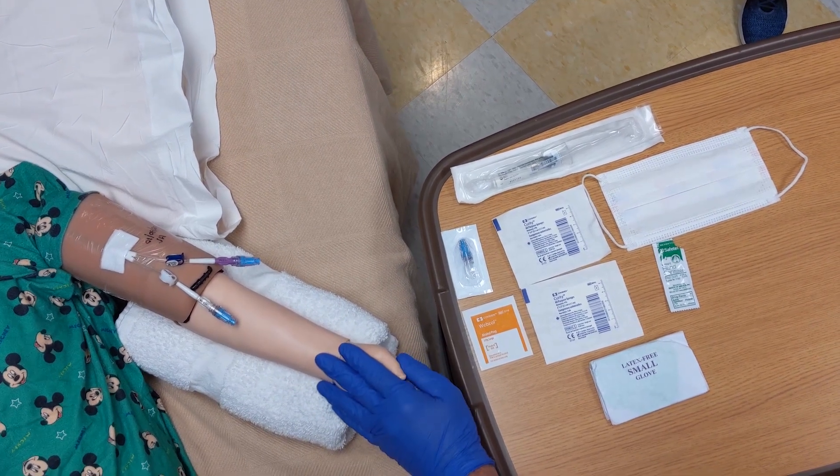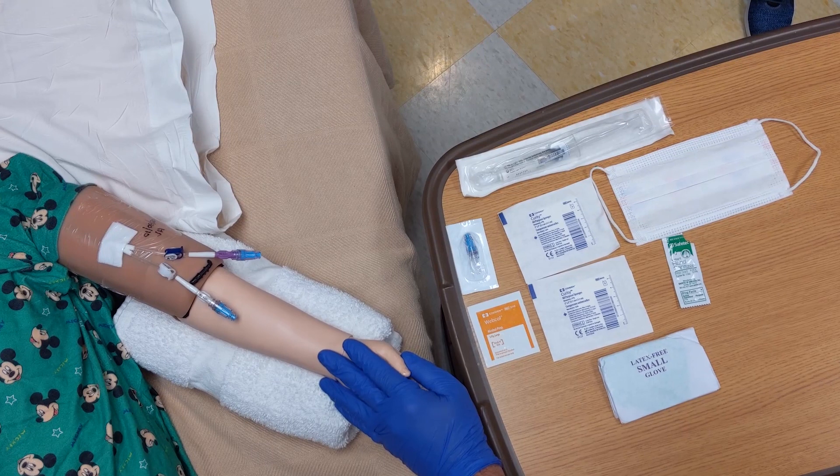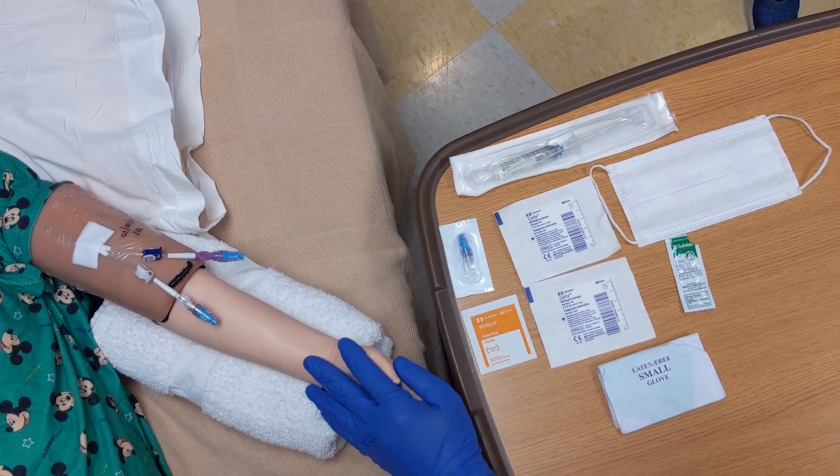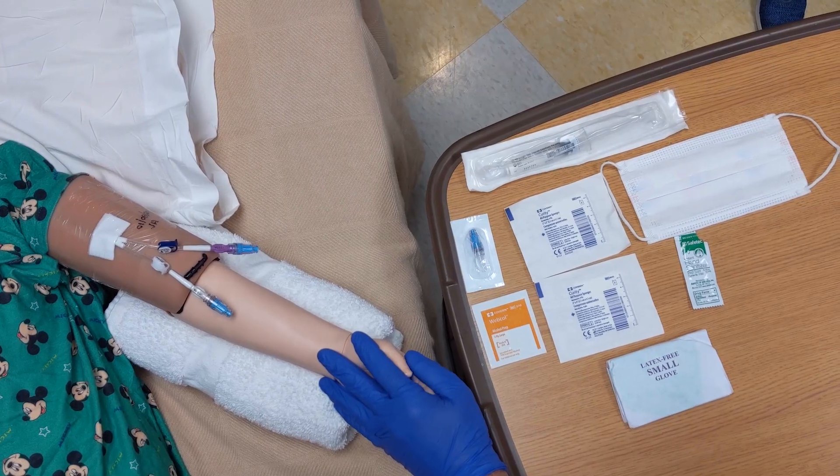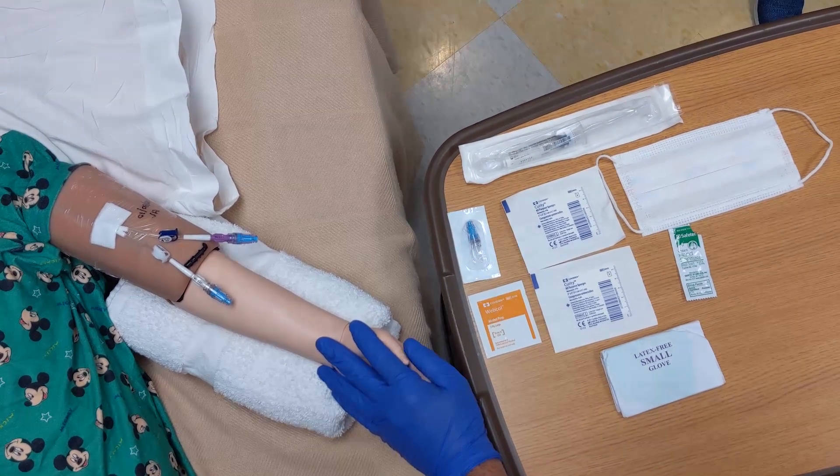This is a GlobalHOPE central venous catheter cap change and line access video. The cap should be changed on central lines every 96 hours, before blood and fungal cultures, and within 24 hours after the administration of blood products.